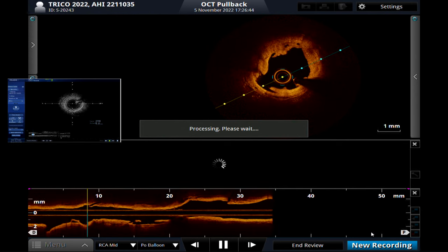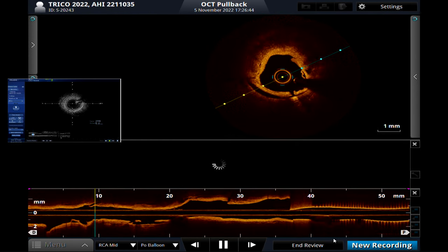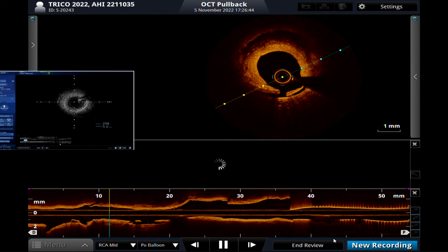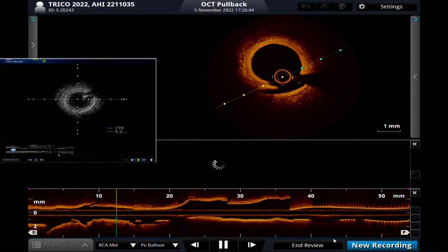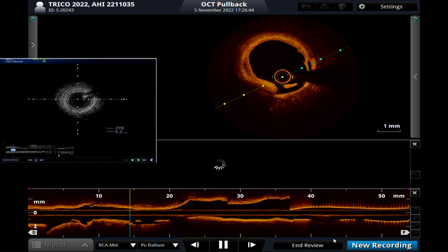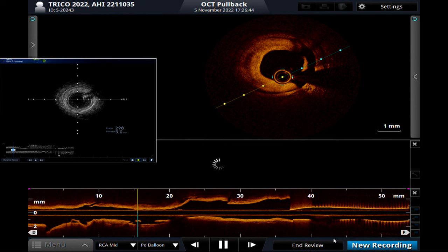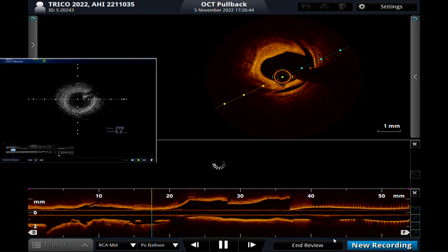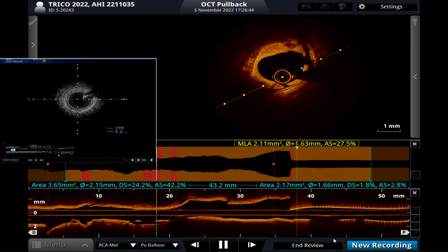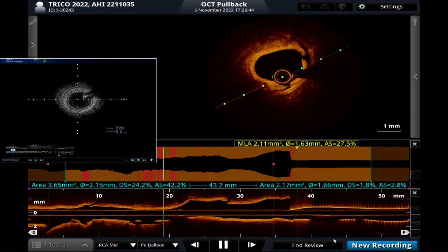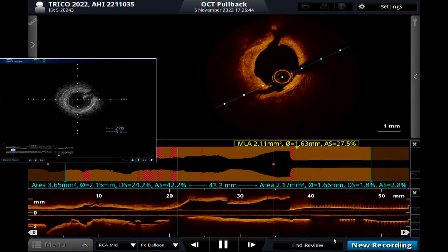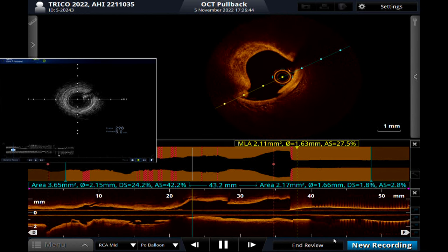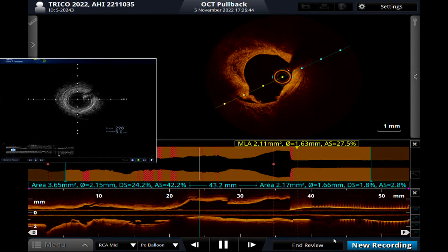There is more dissection in the distal part. There is no stent — confirmed, no stent. Mixed plaque. Calcium here. Mixed plaque with calcium.